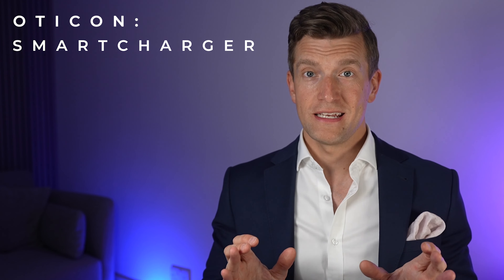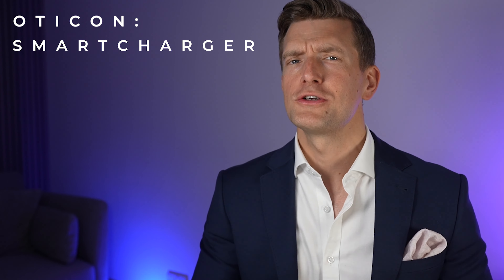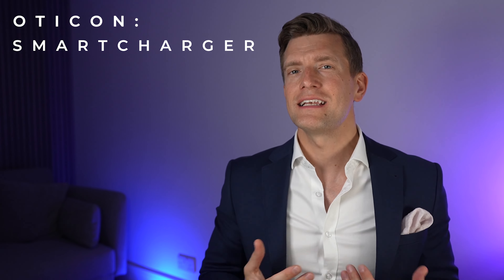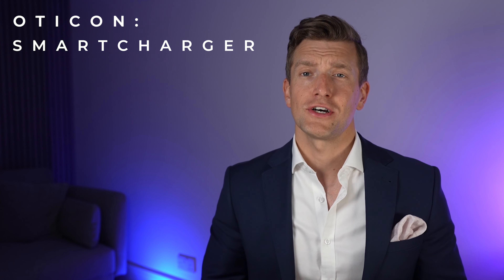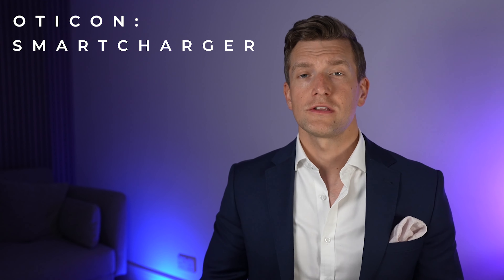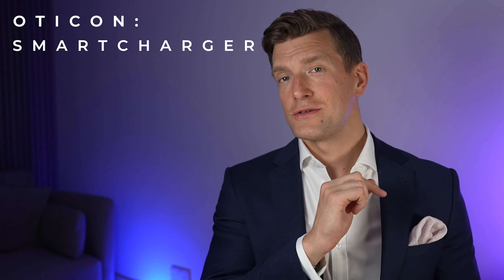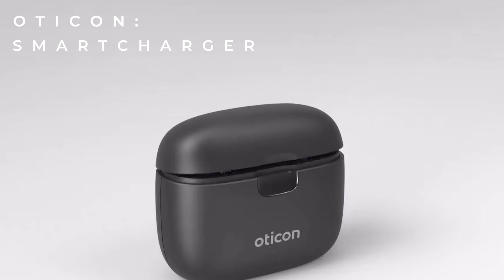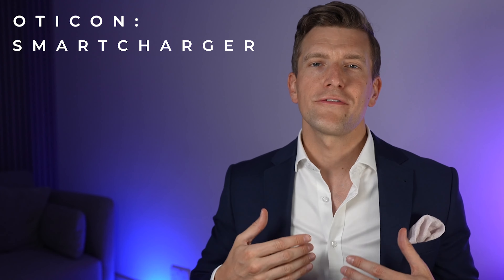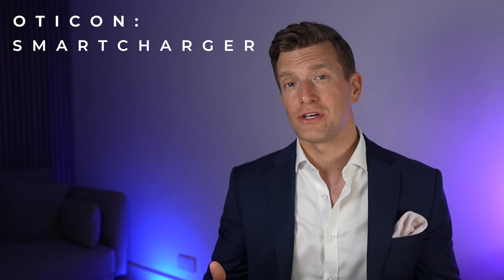One thing that really pleases me is that Oticon have designed the new charger with a closable lid. The LEDs on the back of the hearing aids light up while charging, and I've had patients complain in the past that it stops them from sleeping, so they've had to cover the charger or charge in a different room. With the Oticon Smart Charger, you can simply close the lid and sleep in peace. Having this closing lid also turns the charger into a handy carry case — if you're travelling, you can drop the hearing aids in and they'll be safely stored and charged on the go.